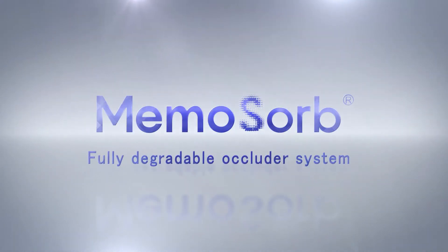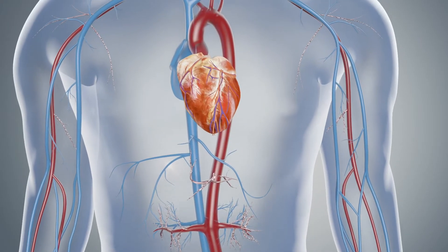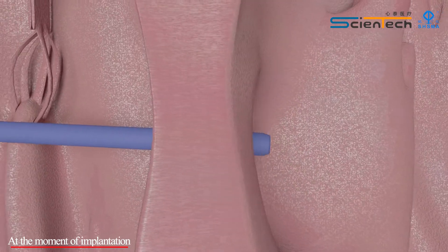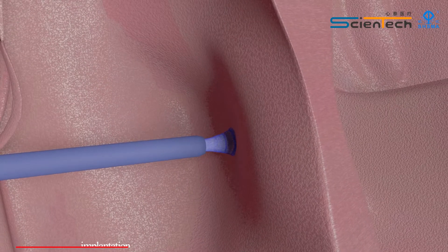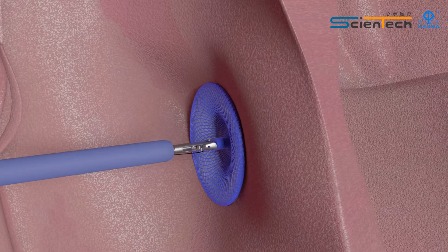MemoSorb, the first and only fully degradable occluder system. Without the use of x-ray, MemoSorb is delivered to the heart using its supporting delivery system. Immediately and completely blocks the hole after implantation.